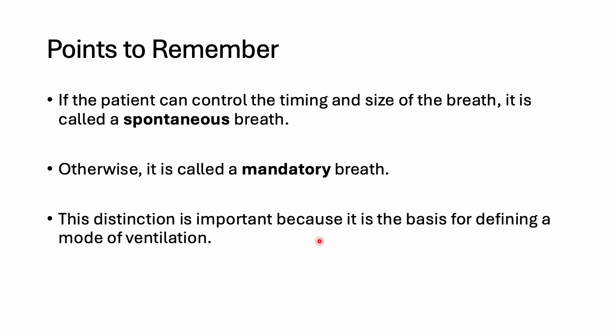Yeah, so then that essentially is the distinction between defining whether the person is on a mandatory mode of breathing or on a spontaneous mode of breathing. Okay, so that's about all we have in terms of the main concepts and principles of breathing.